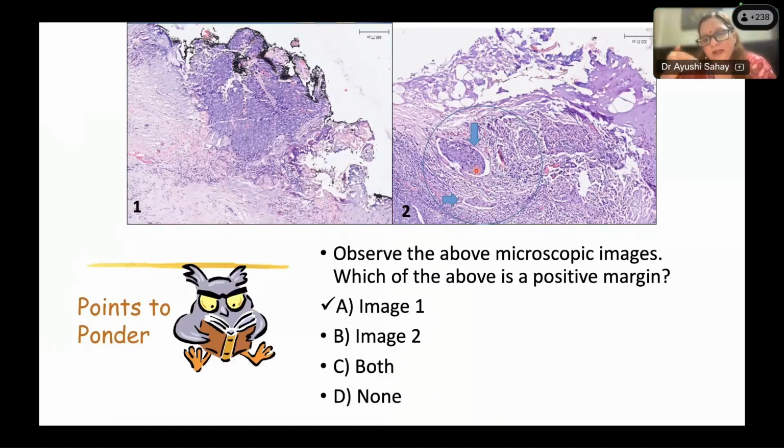If it is a lymphovascular embolus at or even near the margin, it does not make a close margin, because the tumor has already gone away from the primary mass. So this is not what margin involvement means. If the invasive tumor is directly involving or extending close to the margin, that is the distance of the margin. Lymphovascular emboli are not counted as close margins.